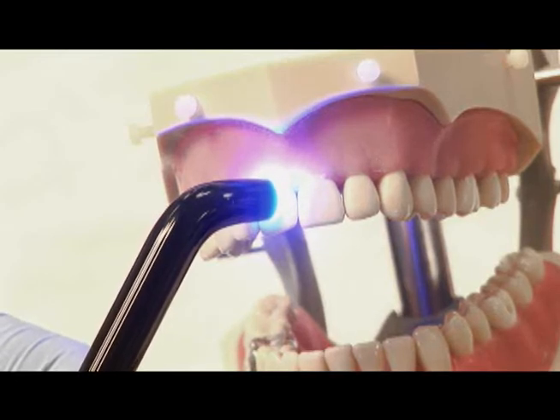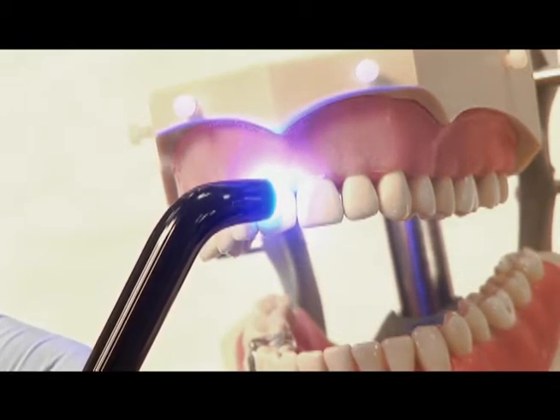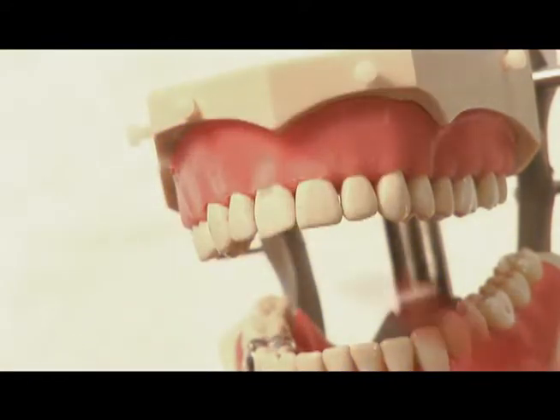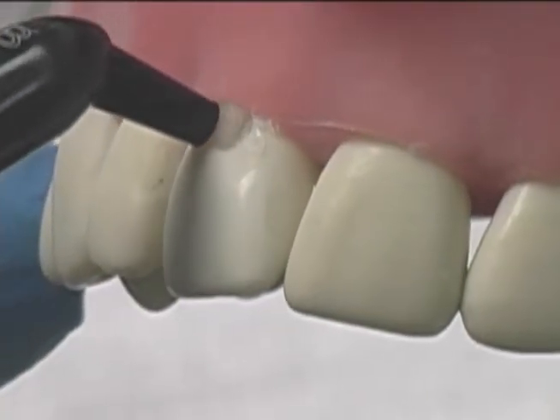We have the benefit with composite of getting our final contours without overfill or with a very minimum of overfill, which reduces the necessity for finishing. This will be the third and final layer where we adapt the composite to the cervical at the gingival.